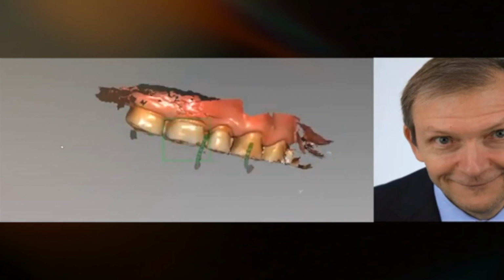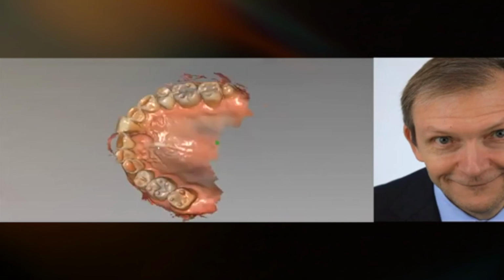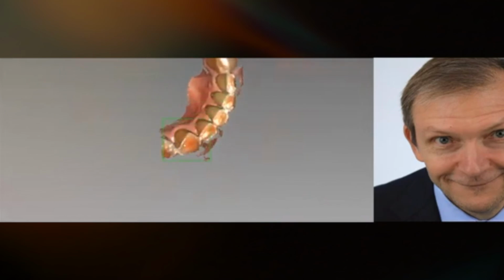The idea with these provisionals was to verify the final vertical dimension of occlusion, to verify aesthetics and phonetics for the patient.